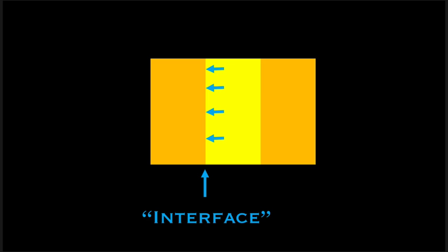So this is a situation where we've got things that are different right next to each other and they're touching, so we can see an interface. So that's one way you can see one. Another way you can see an interface is if things are separated a little bit, like that. Now you can clearly see where one starts and the other one stops, and then the next one starts and then it stops. That's very easy to see.